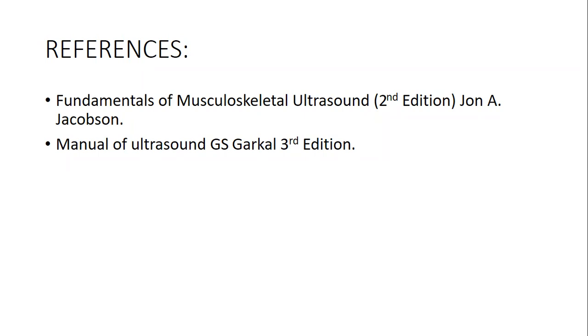So give a view. You may pick something. There may be a lesion, there may be some fibrosis, there may be necrosis, there may be an inflammatory process that has happened there. So go for the lateral portion because that's where you have the common extensor tendon.